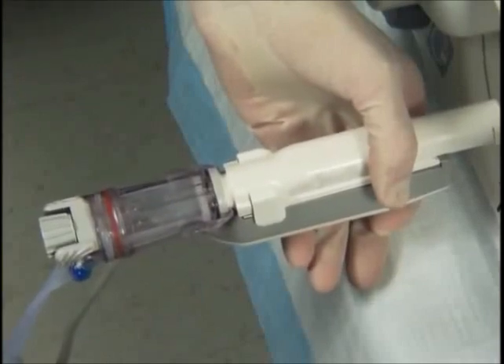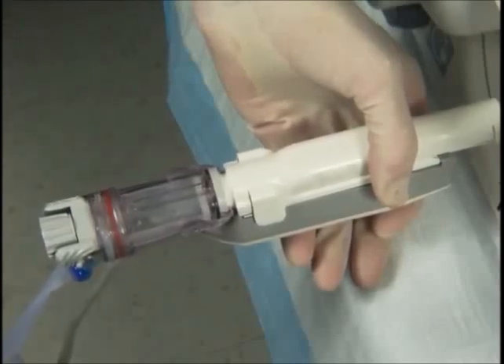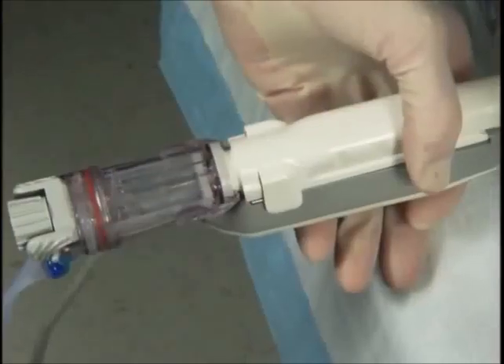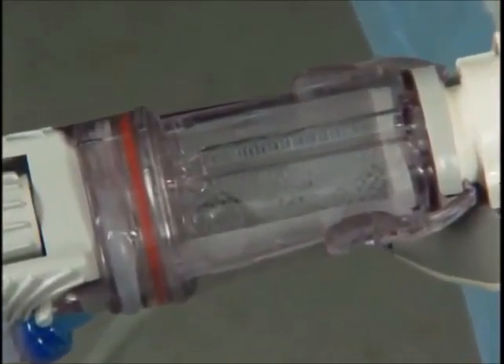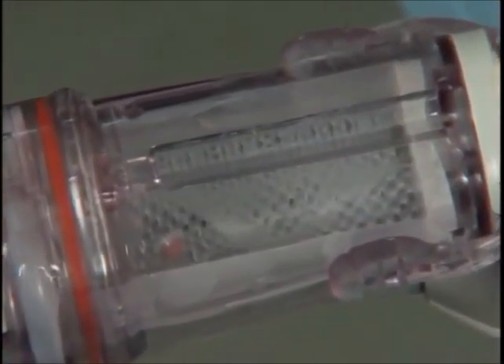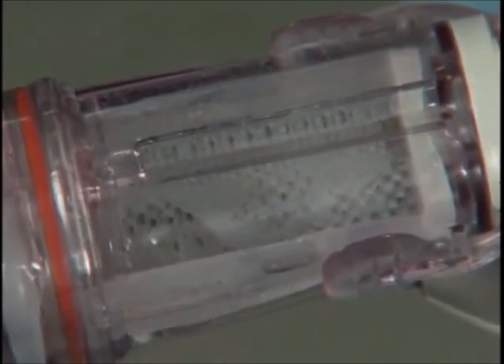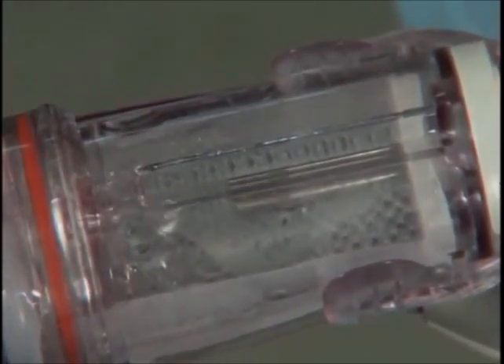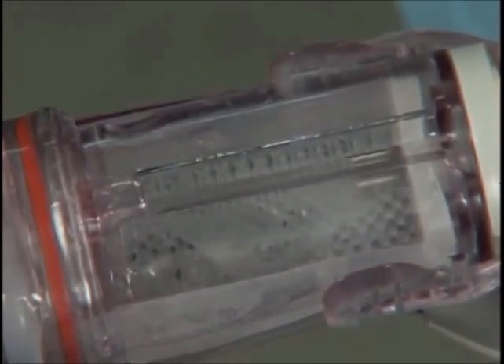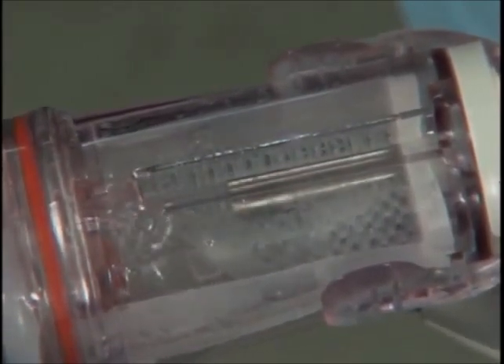Once you've inserted the Centerex biopsy device, check one last time with your technologist that the position and the planned biopsy is recorded within the console, then press the foot pedal or the biopsy button on the gun. The vacuum will start and it will begin obtaining biopsies as planned. With each biopsy specimen, there's automatically a saline rinse to clean the specimen. The gun will complete the planned course of biopsies, and when completed it will stop, and you can release your foot pedal or push button.